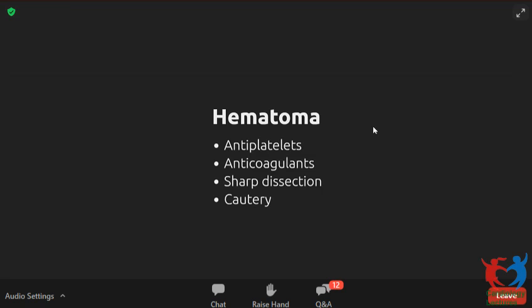Like I was saying, if you make the pocket in the fat, you will see after 2 years when they come that the device has gone low down. If the fat is very loose, it tends to keep extending, and the device migrates in the pocket. So I would say these are the specific problems you have in the obese. Apart from that, I can't think of any other major problems.